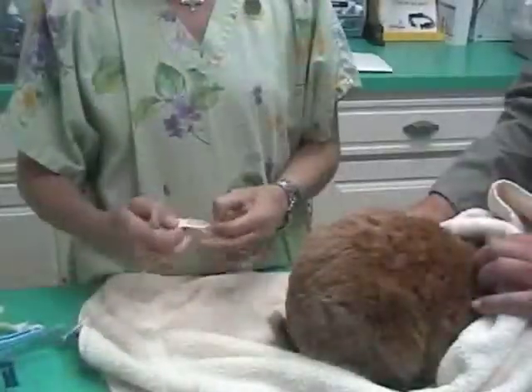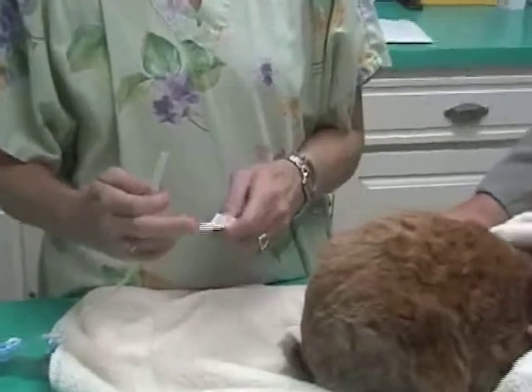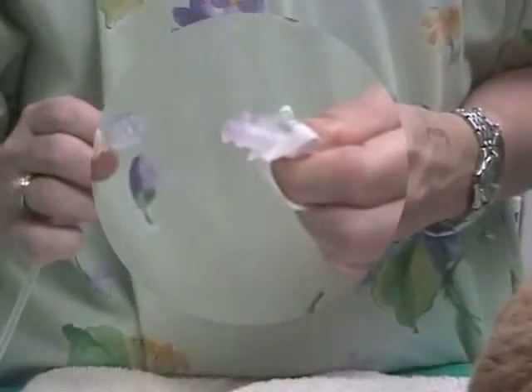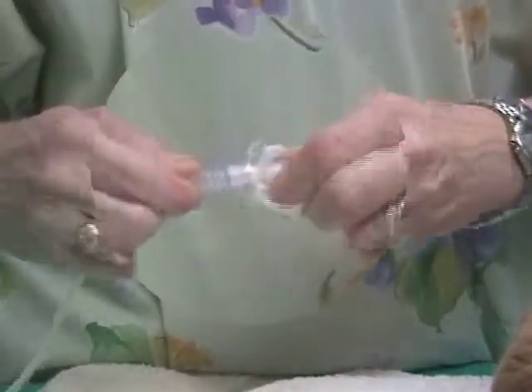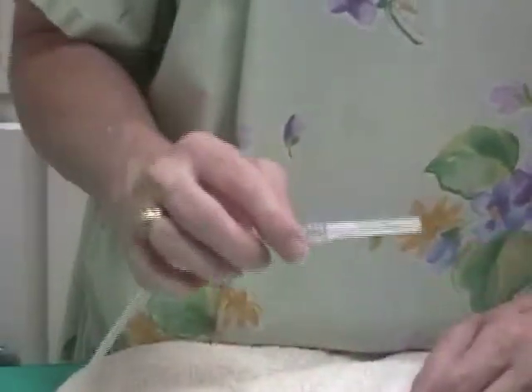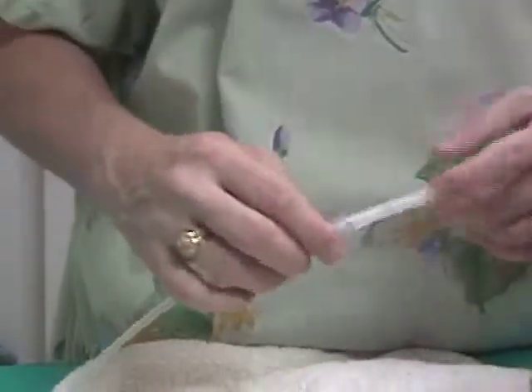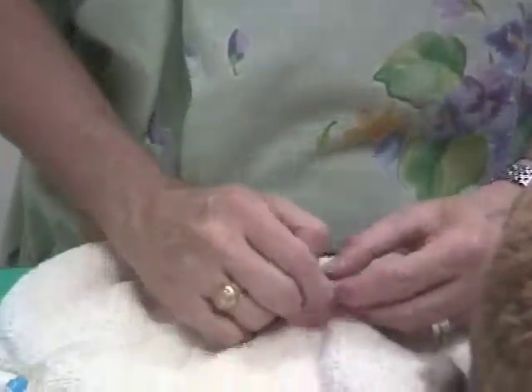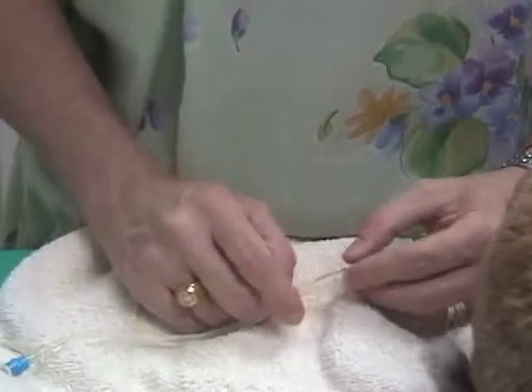You always want to use a new needle. You want to replace the needle that you used and dispose of the other needle because the needle has gone into the skin, therefore is contaminated, and contamination can travel up the line and contaminate what's in the line and what's in the bag. So you want to replace the needle immediately after giving fluids.